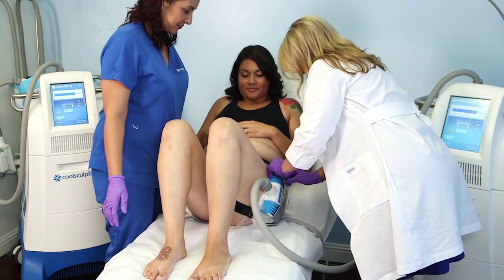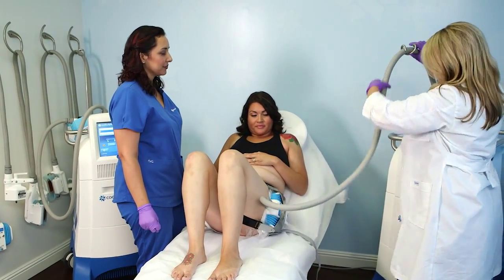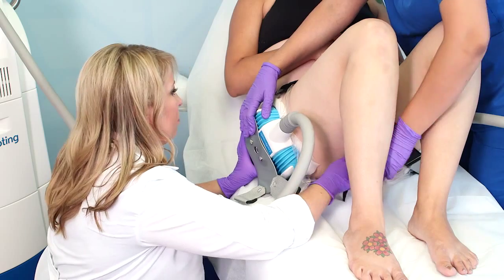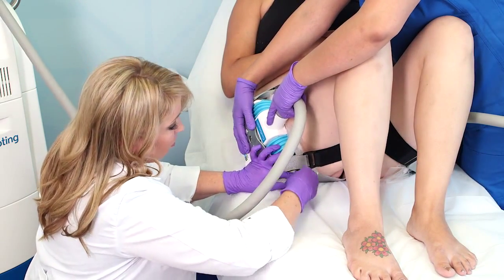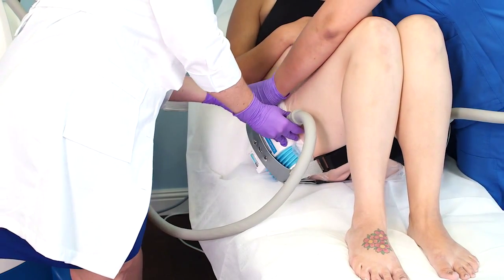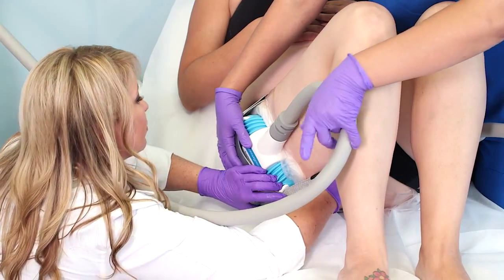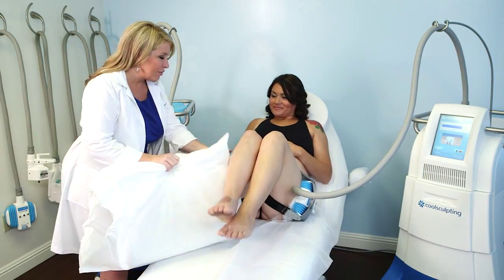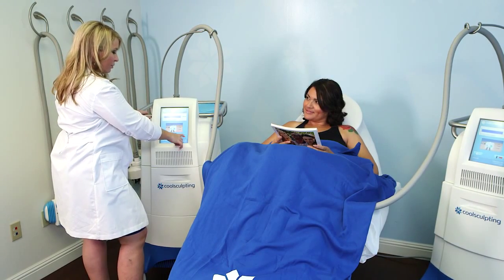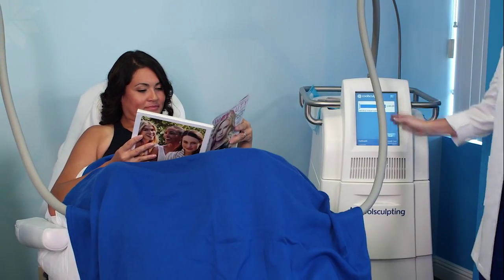Once all straps are in place, begin to tighten on all four sides so there is no movement of the applicator. Secure the first applicator in the support arm and position the second applicator inside of the foam borders with the umbilical going down the leg. Loosely secure the black strap around the inner thigh and secure gray strap one closest to the buttock. Help the patient lift their body again, pull the extra slack, and secure the other end of gray strap one across the top of the body and loosely attach it to the securement anchor. Once all straps are in place, begin to tighten on all four sides. Adjust the treatment bed to get the patient into a reclined position and use pillows to improve patient comfort. After the patient is in position, engage cooling on the first applicator. Wait approximately five minutes before starting the second treatment to allow time for the manual massage at the end of treatment.